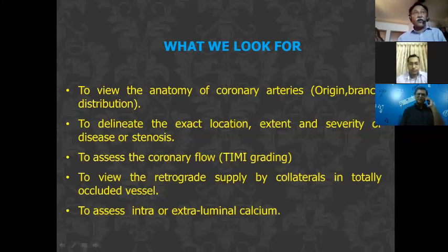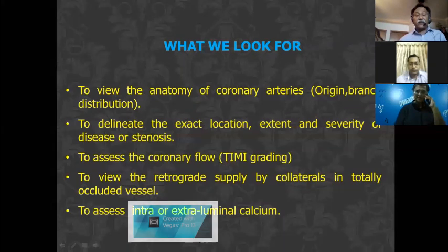This is important from a therapeutic point of view, because diagnosis is not all you need. You also need to guide the therapeutic intervention. So nowadays, a lot of CTO patients we are getting. If you don't see the retrograde collateral, we cannot plan what to do for that. And also assess the intra or extraluminal calcification.